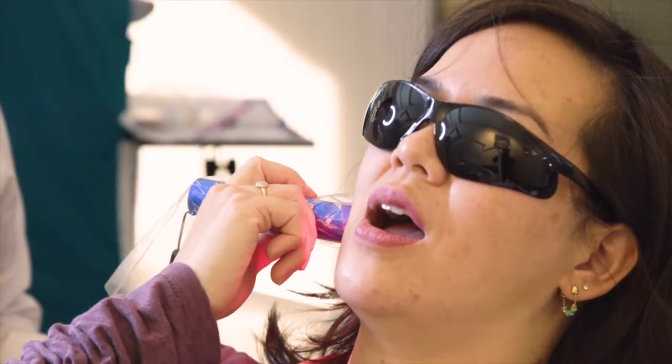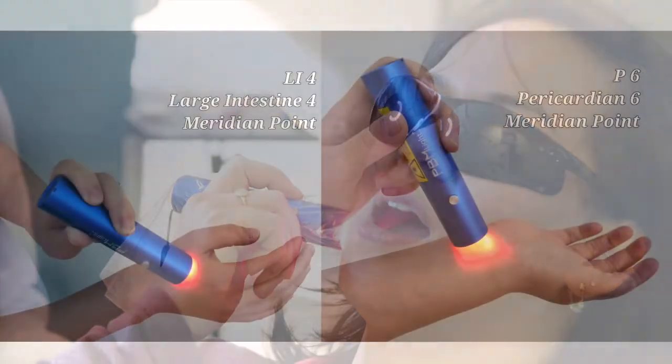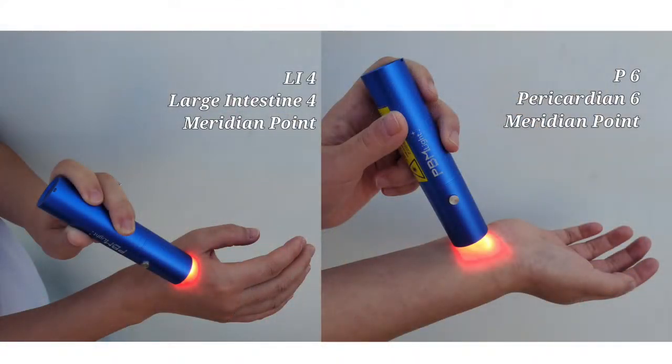We can also apply the light energy on the meridian system to receive additional beneficial effects. The famous LI4 is great for pain relief. P6 — Pericardium 6 — can activate the parasympathetic nervous system, producing a calming effect, reducing anxiety, and better controlling the gag reflex for dental impressions.